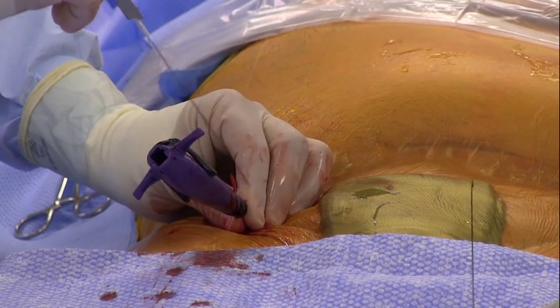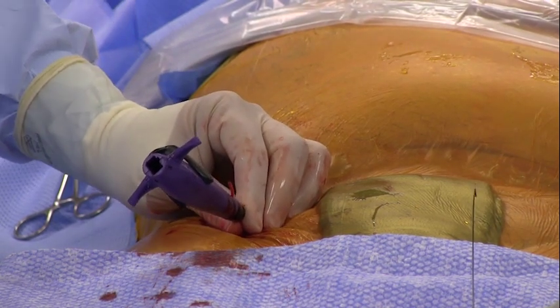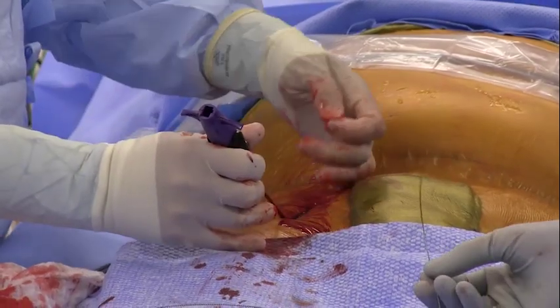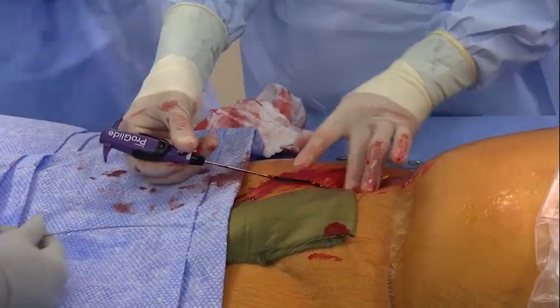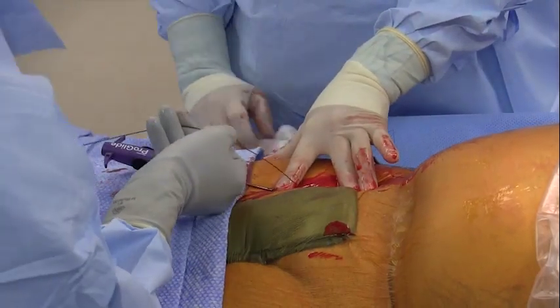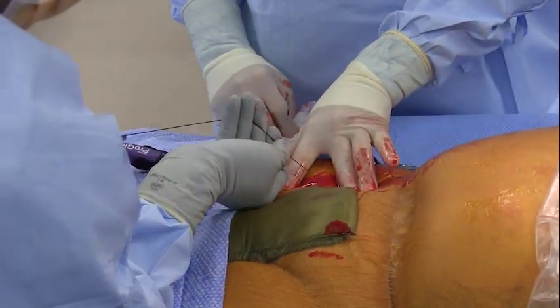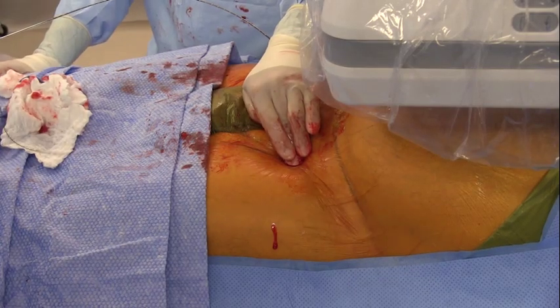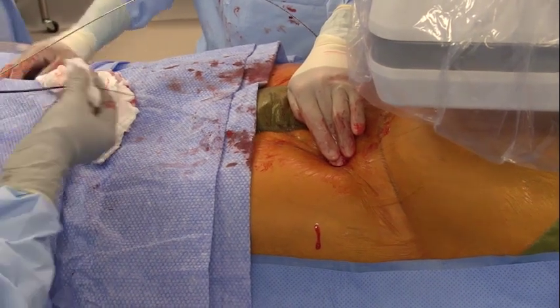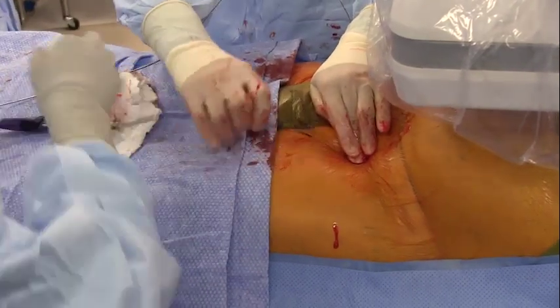Continue to maintain wire access and deploy the second device with a 30-degree lateral rotation. Then exchange the device with a 6 French sheath. Repeat the pre-close process with the contralateral access site. Alternatively, the pre-close procedure may also be performed with a single 10 French ProStar device.